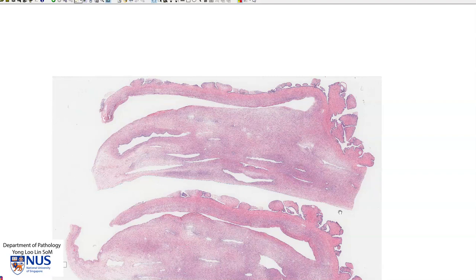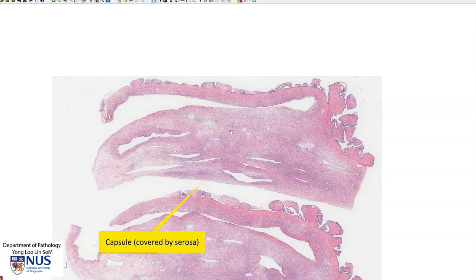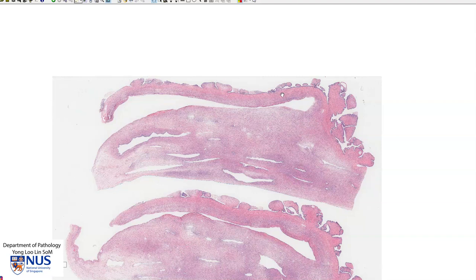To orientate ourselves, this is the capsule of the ovary or the serosal surface. This is part of the cyst wall and this is one of the septa within the cyst. The cyst has several locules, which are the rounded spaces within a cyst, and these locules are separated from each other by septa.